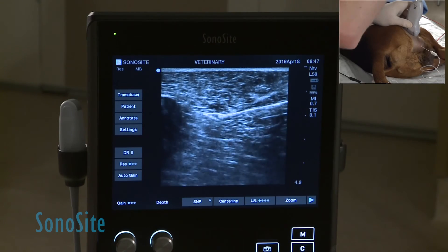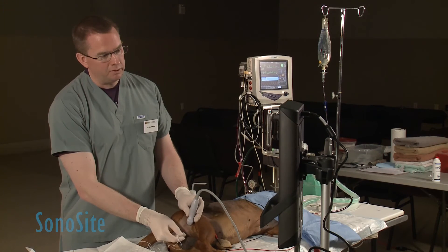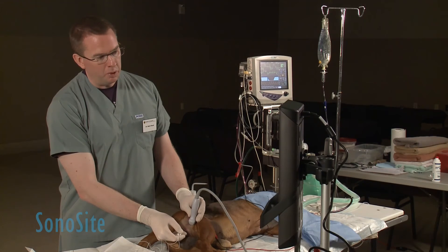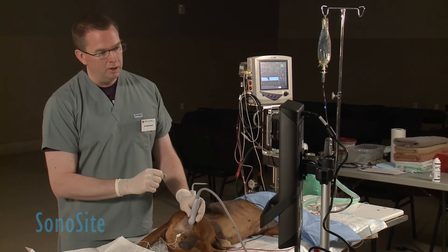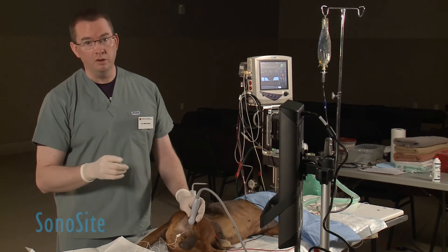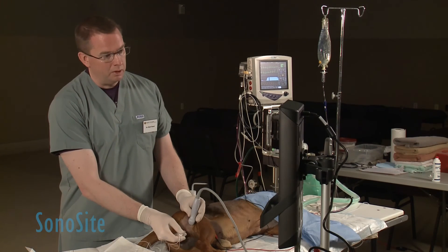We don't always get good spread on top of the nerve, so we're happy if we get good spread underneath. After that, we scan again with the transducer to evaluate the extent of the local anesthetic spread, making sure it looks appropriate to the dose given. The typical dose for this block is between 0.05 and 0.1 milliliters per kilogram of local anesthetic solution.